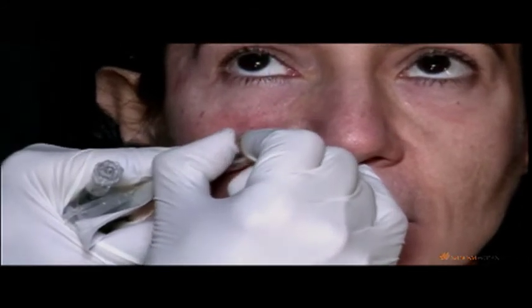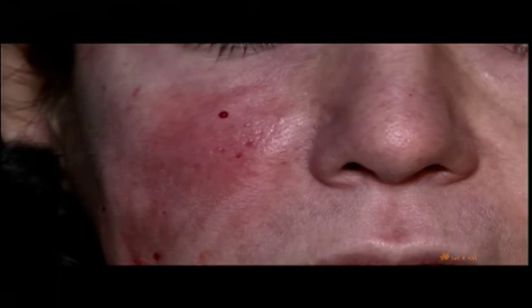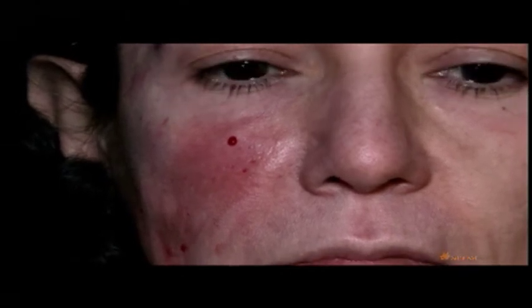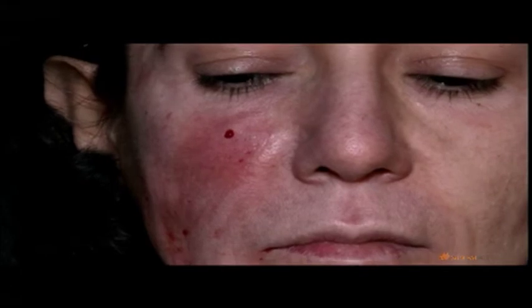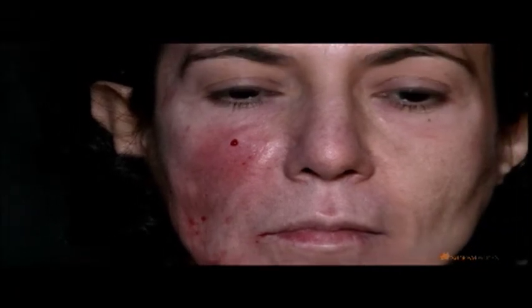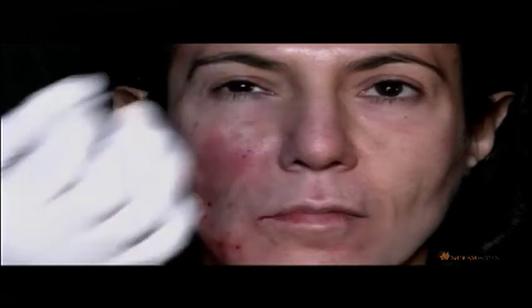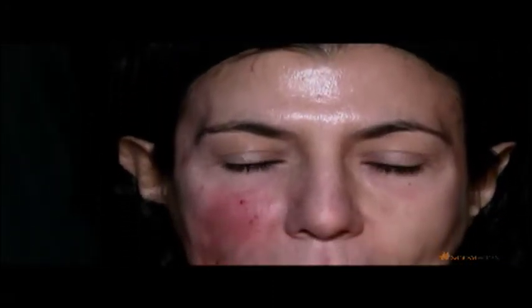Here's my entry point. We want to stretch it out a little bit because we're using a needle which is not a whole lot bigger than the cannula itself. And I like to keep it around in case I need to go back to it. So the size of that entry point needle was what again, Hema? Well, I'm staying away from the orbital rim, as I mentioned, because of the infraorbital foramen and the infraorbital neurovascular bundle. Okay. This is our blunt cannula, so it doesn't have an edge to it.